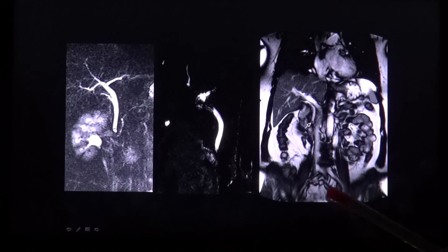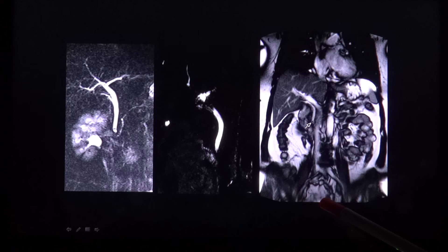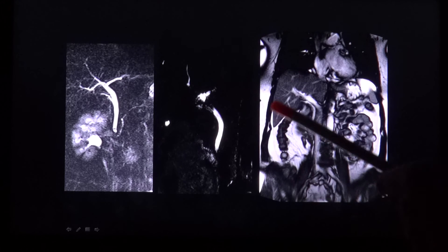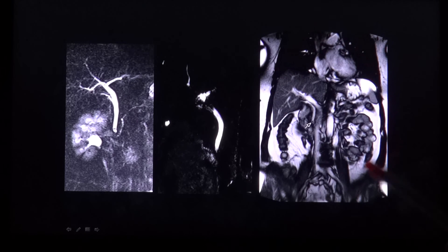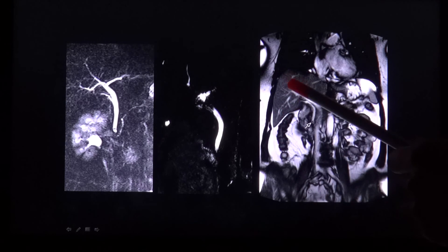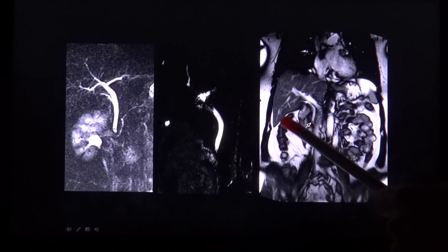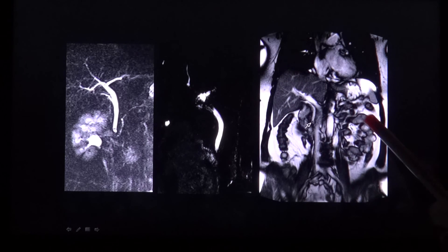With MRI you have the advantage of being able to evaluate the perioductal tissues and organs as well, and thus ruling out an extrinsic obstruction of the bile duct, which can lead to the same symptoms. Here, for example, you have a sequence which shows you the whole abdominal organs like the liver, the colon, and the intestine.